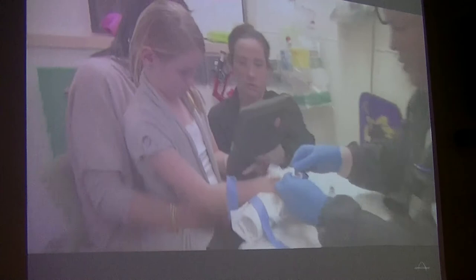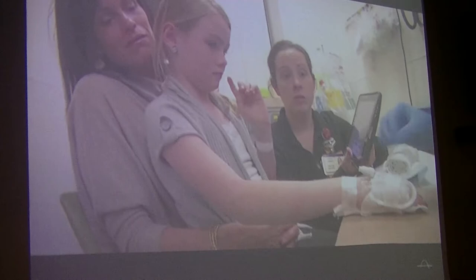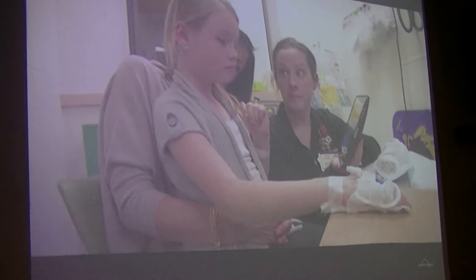That's all there is to it. If it gets bumped, can I see it? It won't hurt. So now you know, no more sticker on the top. No more poles. There you go. Whenever you need your medicine, it doesn't go into you, it goes into this tube thing. Okay? Good, that's it. Good job. High five. Good job.